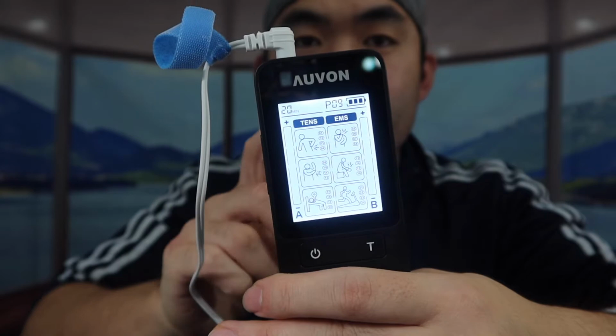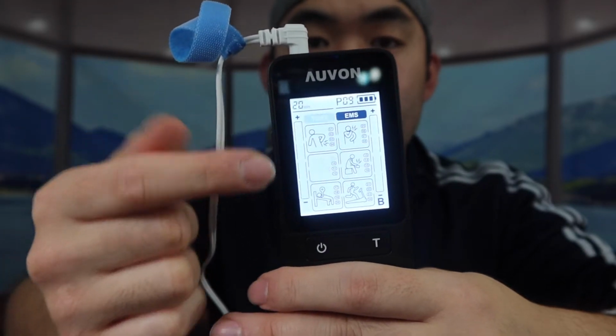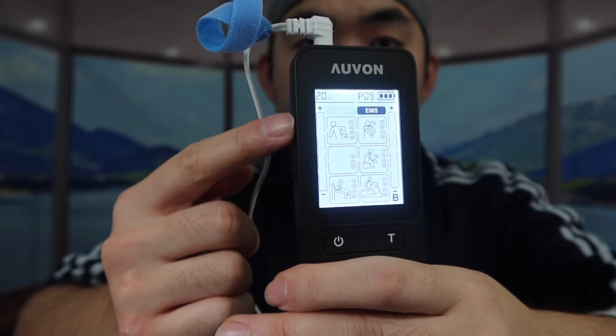Once you have it on, this is what it actually looks like right here. So once you're ready, you want to select what you want to use. And you want to increase the intensity level on the side right here. So it's going to be hard for me to show you what's on the screen and also this at the same time. But I'm testing it out, increasing the intensity level on here to show you what it actually looks like. So I'll slowly bring it up.